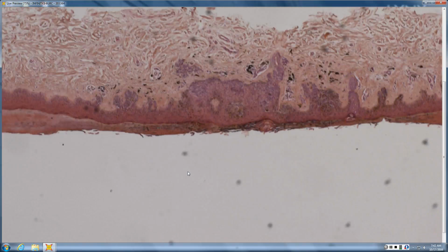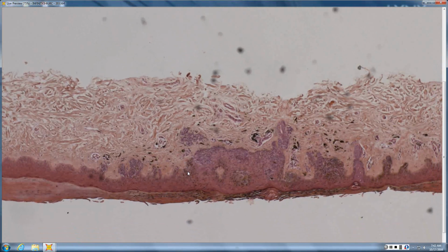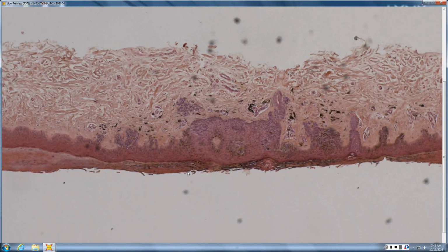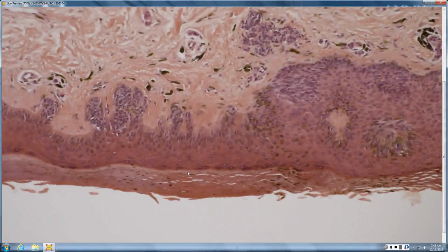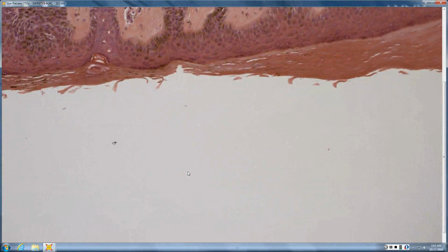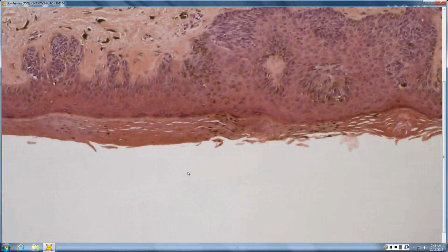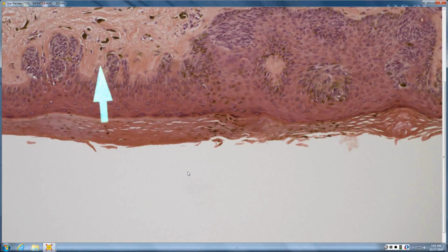So it looks like a compact horn on acral skin. In the middle, there's a bunch of pigment. Can't see. It's like some kind of acanthoma in the middle. I guess there's just a bunch of little nests there, and it's okay to have it floating up. Those look sort of mildly evil.